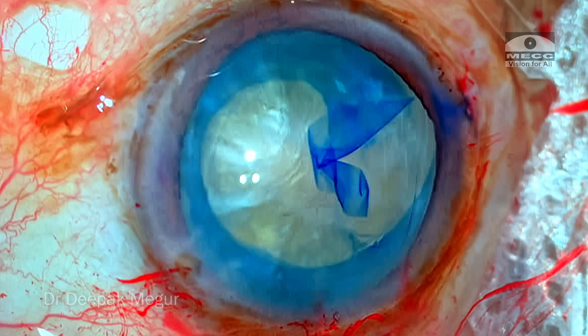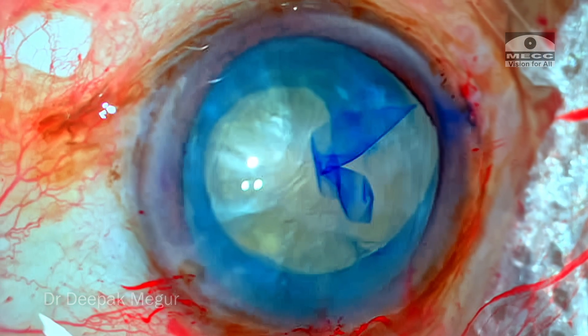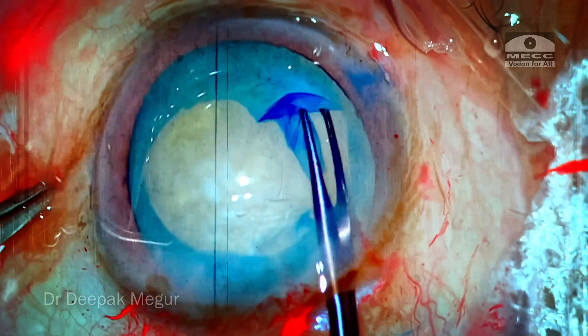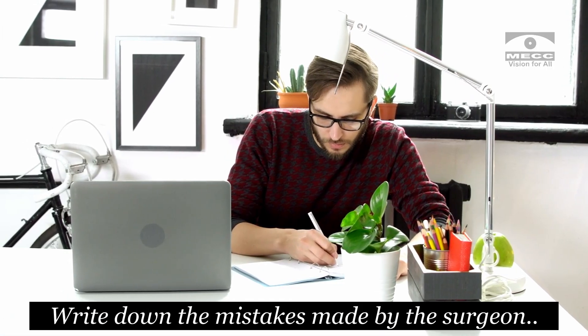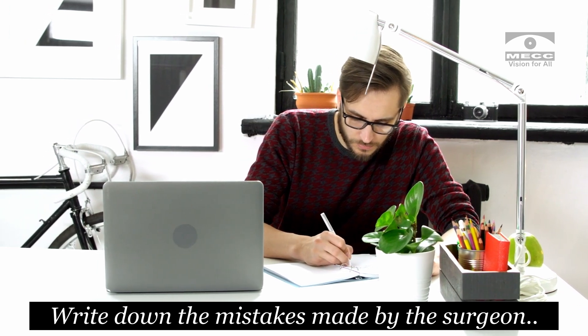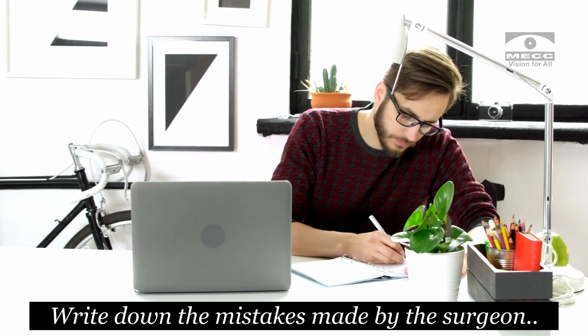It has headed to the equator. At this point I would like all of you to pause the video, rewind back a couple of minutes, and then take a pen and paper and write down what mistakes the surgeon made so that the rhexis retrieval was unsuccessful.